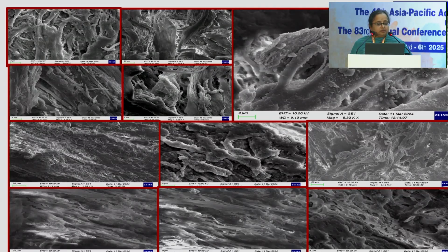We don't know. So when we do a scanning electron microscopy, we find that there are very bright, if I might say, electron-dense deposits deposited all over the juxtacanalicular and the corneoscleral meshwork, but absent in the uveal meshwork. You can see these bright deposits here which actually light up, and these are mostly only on the surface of the trabecular meshwork beams.